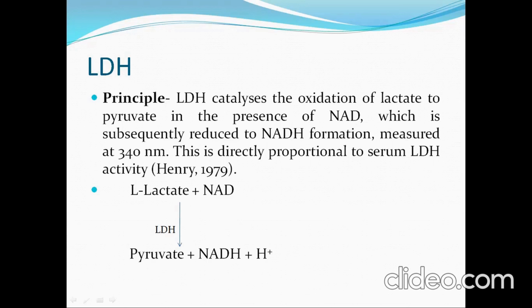LDH. LDH means lactate dehydrogenase. LDH catalyzes the oxidation of lactate to pyruvate in presence of NAD, which is subsequently reduced to NADH. The formation is measured at 340 nanometer. This is directly proportional to the serum LDH activity. The principle behind that is L-lactate plus NAD in presence of LDH gets converted into the pyruvate and NADH.